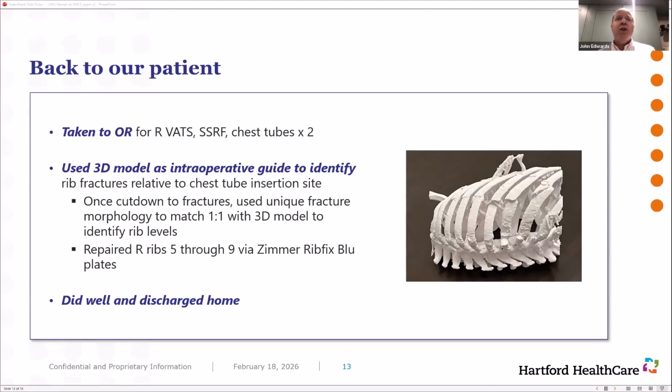The non-union cases are good because it helps you visualize density quite nicely so that you can determine when you might need to use a bone graft. And I think that sort of thing is quite useful in advance. The other thing I find difficult is that I can do my own 3D reconstructions in seconds, but it's actually quite difficult once you have a 3D radiologic model on the PACS system to then apply measurements to it.